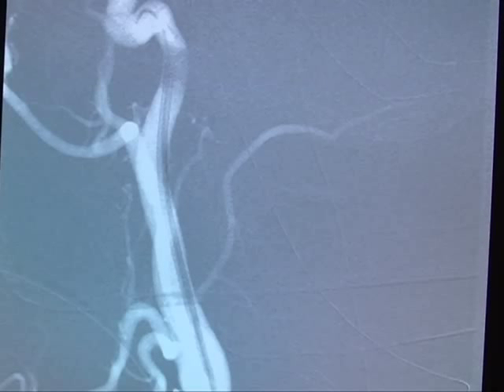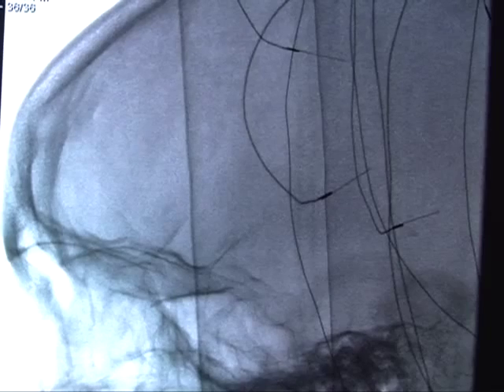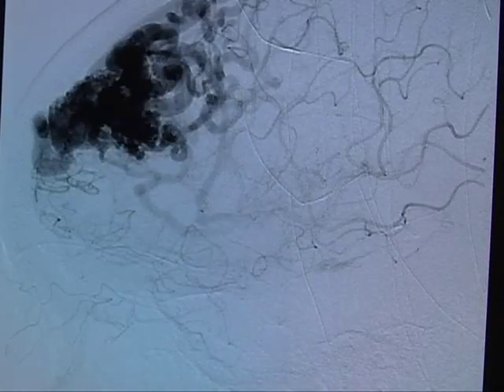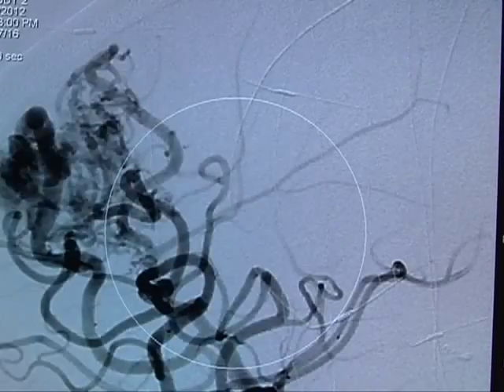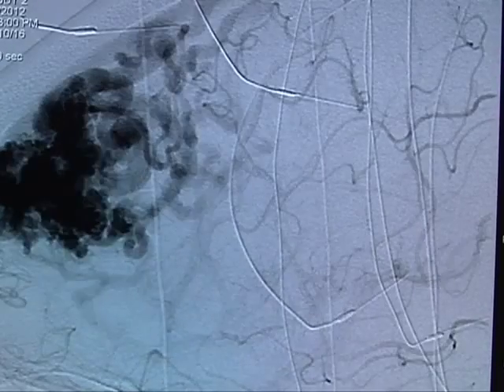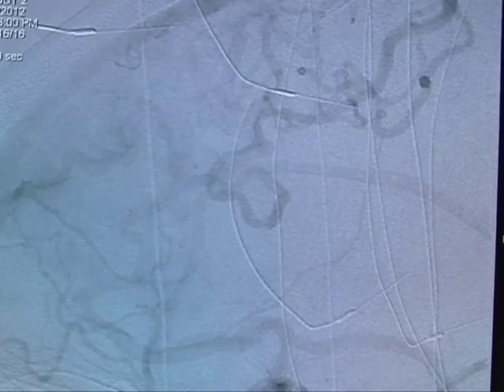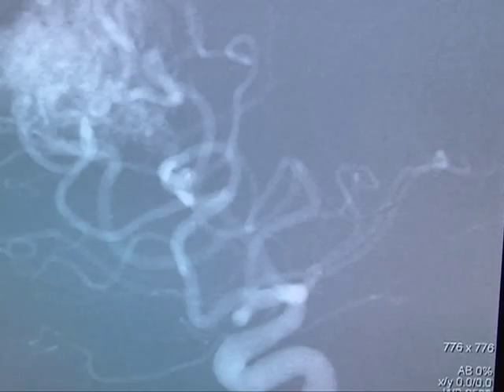Here, we see a base catheter in the left internal carotid artery. An arteriographic run is done, showing a tangle of blood vessels in the left frontal lobe. This is the arteriovenous malformation. This will be removed surgically after embolization is carried out.